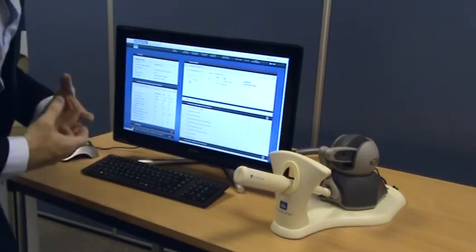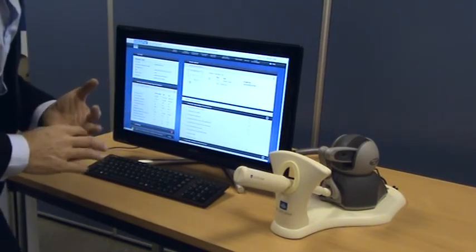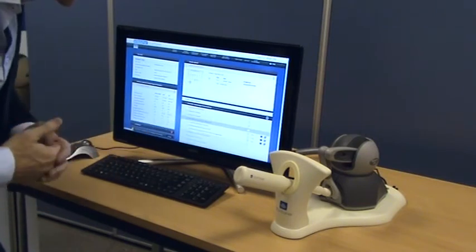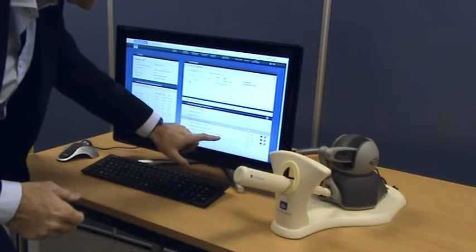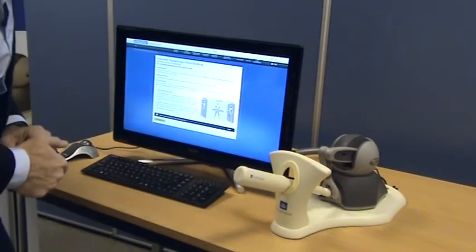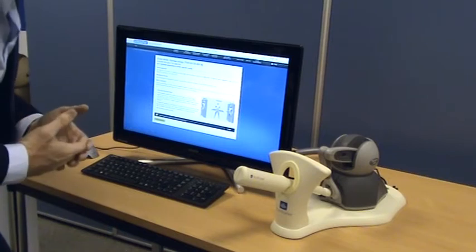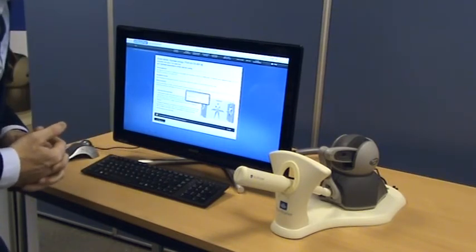The system has lesson plans for both gynecology, all the key skills there, and also obstetrics for an early pregnancy at 11 weeks. But if we look at the gynecology module for a start with, I'm just going to do a simple module here, examination of the uterus and the sagittal plane, and 4.2, optimal assessment uterine cavity. Click take lesson. The system opens up the lesson, explains what the lesson is. We always explain what the scanning planes are, just so there's no confusion, and then we click take assignment.